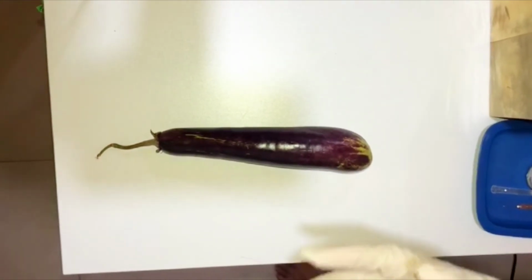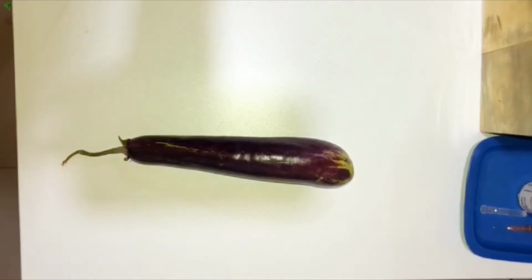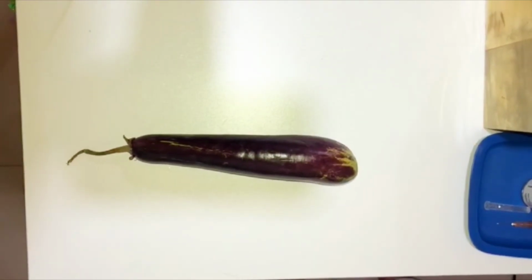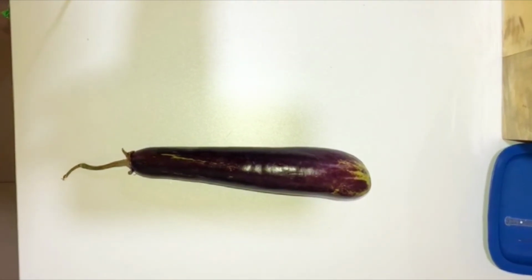And always remember, do not massage the area. Encircle the wheal with a blue or black ballpen and instruct the patient not to rub the wheal or erase the mark.